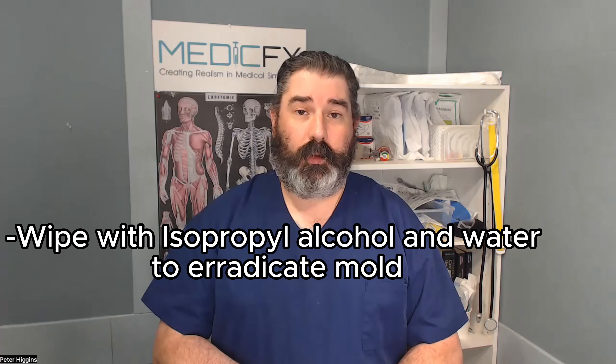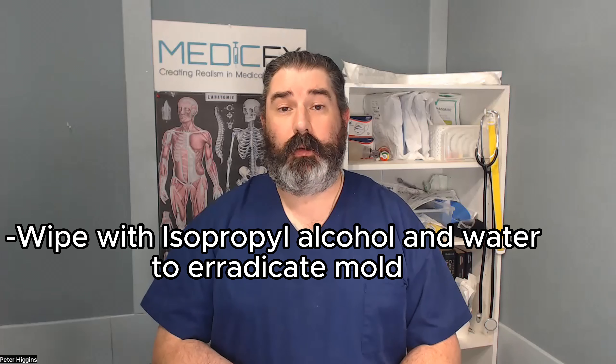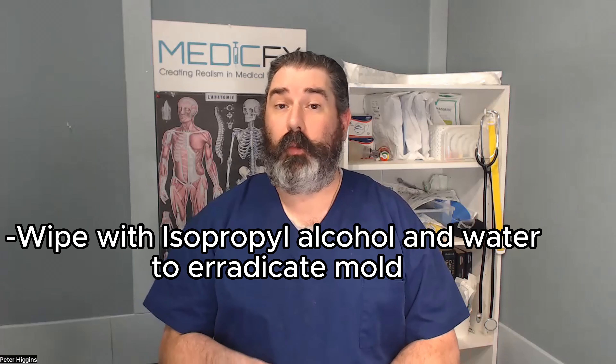So that was the setup for Conan. It's a fairly simple model to put together. Cleaning and maintenance: you're welcome to use warm soapy water to clean him off — just make sure that when you put him away, he's nice and dry. If you're concerned about mould, wiping down with a 50-50 mix of iso alcohol and sterile water is probably the best way to go. Ensure that the mouth has been cleaned out if any of your participants have been instrumenting the airway, and just make sure it's nice and dry inside by passing a swab through.